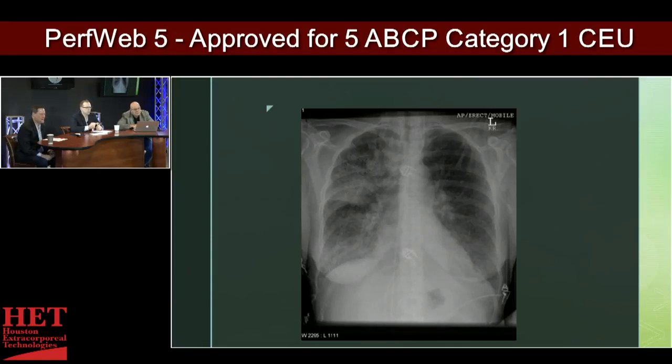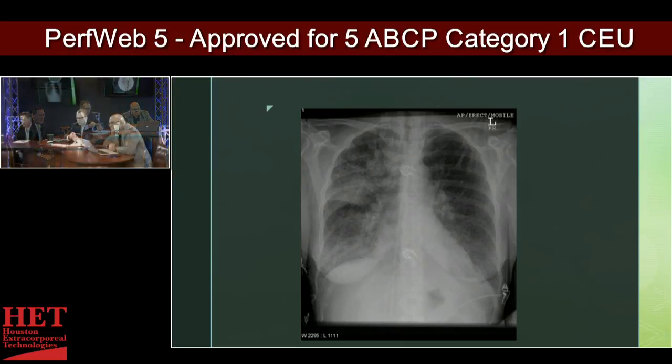So the method I go through, again, just for you guys at home, write this down and stick it on a note card and put it in your pocket. Every time in the OR they pull up an x-ray, or if you're at the bedside in the ICU running an ECMO circuit and they pull up an x-ray, I look at the bone structures, normal. I look at the soft tissue structures and describe what you see in the soft tissue.